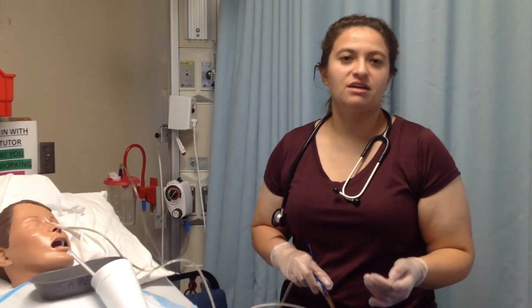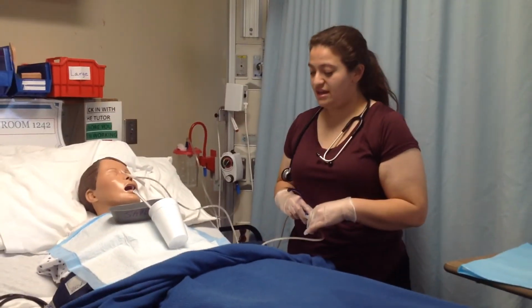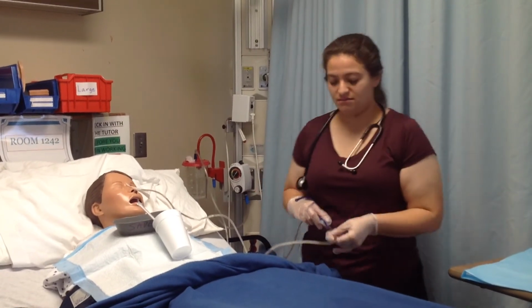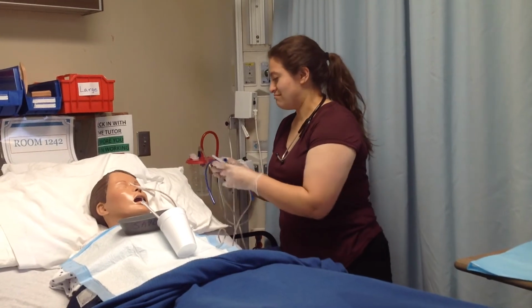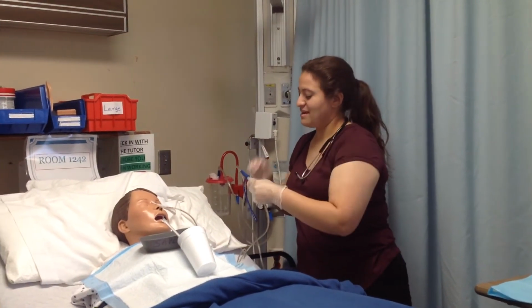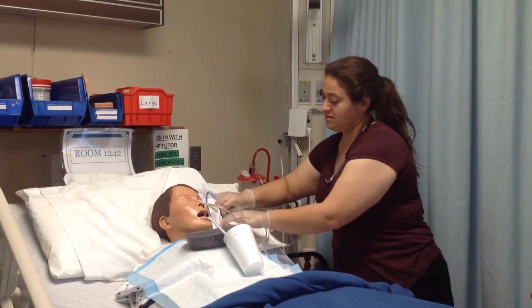And I just want to document that. That way, if another nurse comes in and it does move, they would be able to know if it moved, depending on how long it was. So once I've done that, ideally that wouldn't have happened. I'll just cap that back up and keep that up.